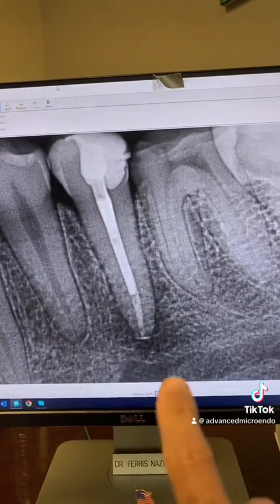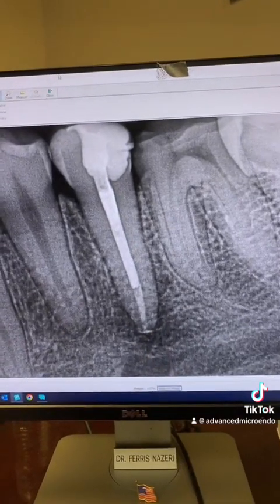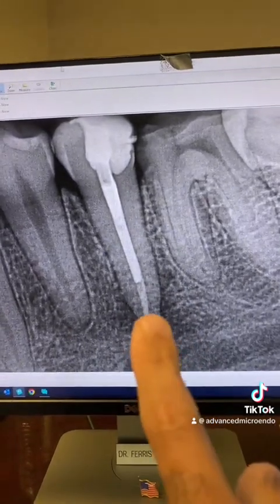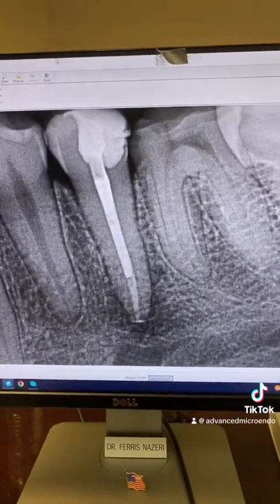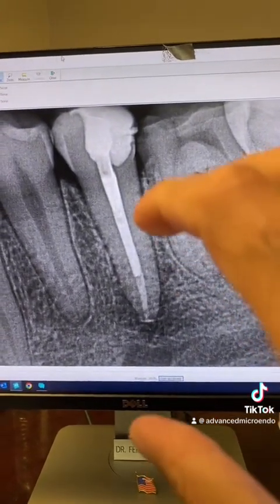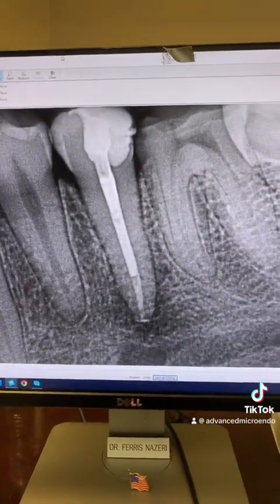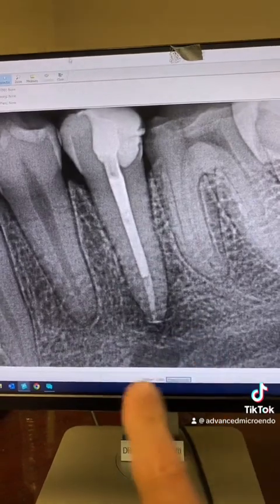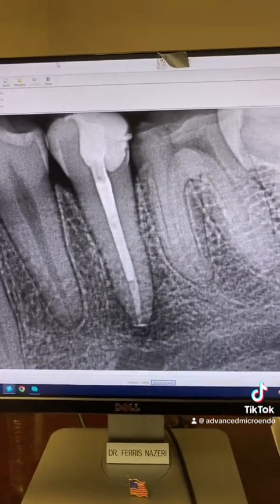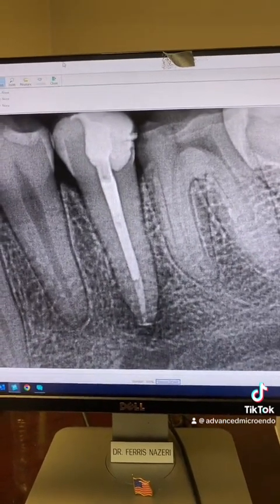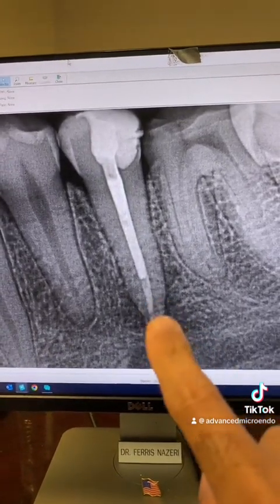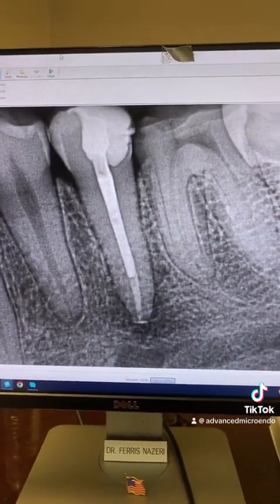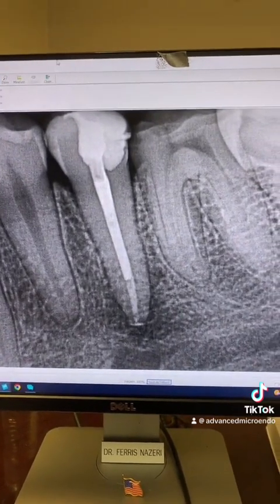MTA is especially valuable when you're working near sensitive anatomy like the mental foramen. With a large apical diameter, gutta-percha and sealer can get extruded out of the canal and into that space, which can really cause problems for you and the patient. MTA is more manageable, seals better, and that's why I use it when the apical diameter is 50 or more.